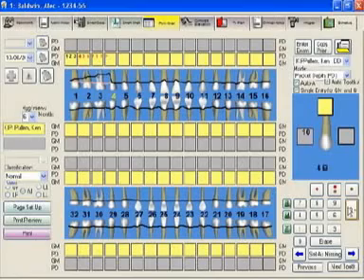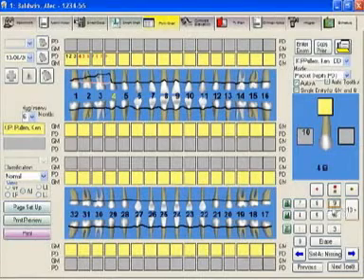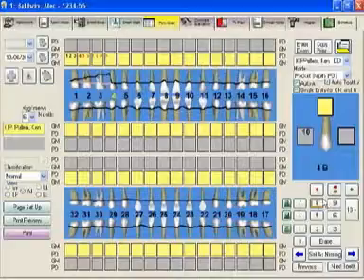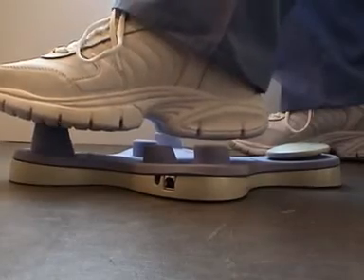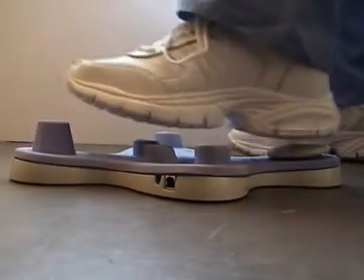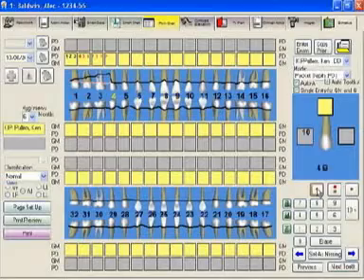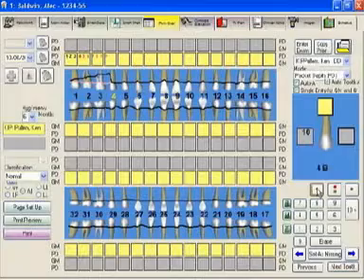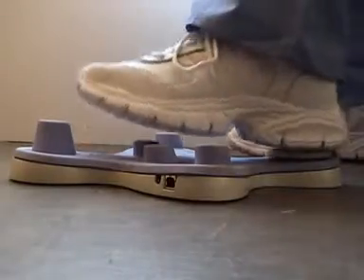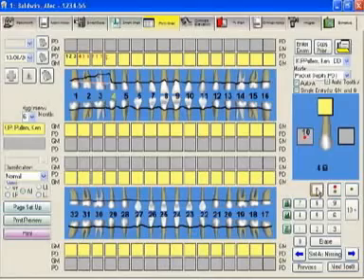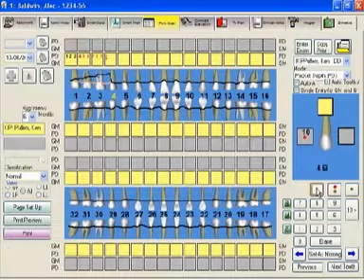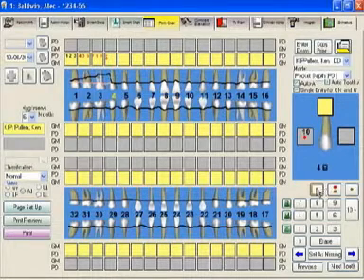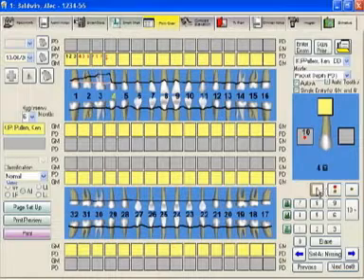Your heel button is working as your leg rest, but it's also your left mouse click. So what I usually recommend doing is putting your mouse over on the bleeding point, just up here on this bleeding spot. And then as you're doing your numbers, any time you rock back on your heel, it's going to mark a bleeding point.